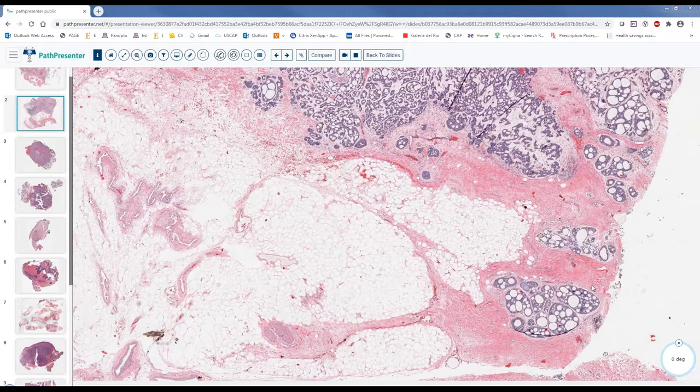Any question about adenoid cystic carcinoma that I didn't cover? Yeah, radiology and gross examination. Basically, you'll see the tumor going beyond the limit of the normal boundaries of that salivary gland. That makes it extra parenchymal extension, but not just finding tumor in the fat. All right. Okay, sounds good.